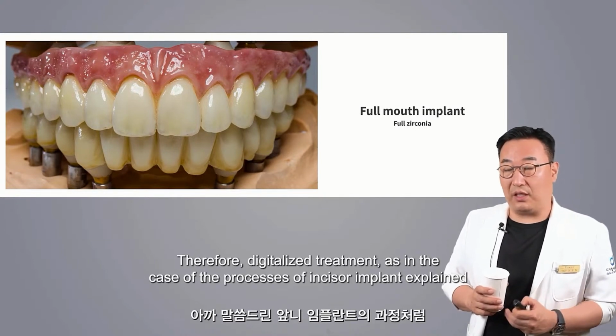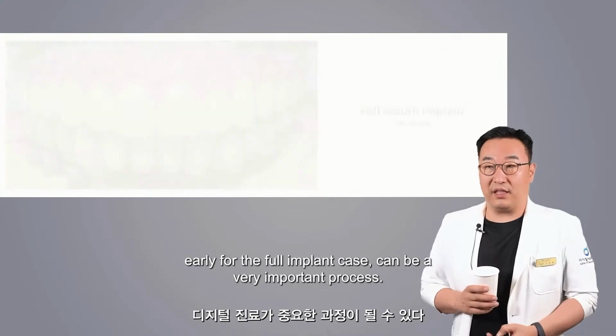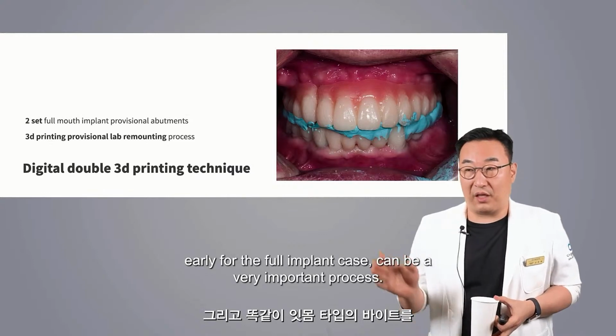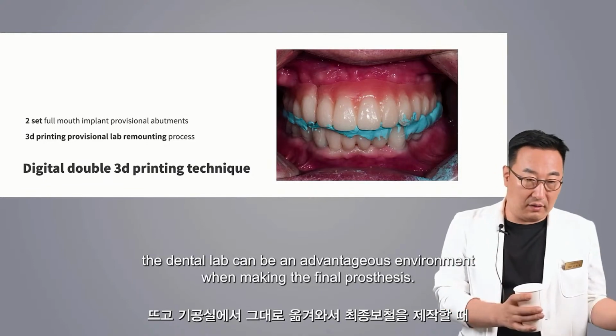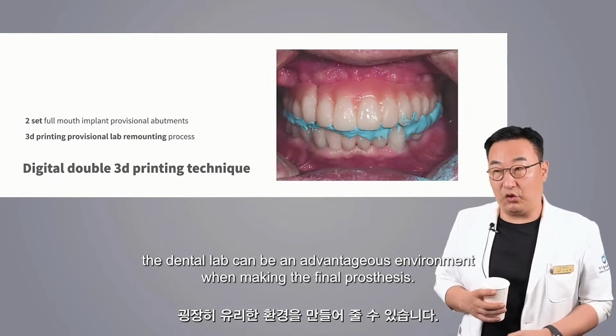Therefore, digitalized treatment, as in the case of the processes of incisor implant explained earlier for the full implant case, can be a very important process. In addition, by taking the bite of the same gum type and transferring it straight from the dental lab, it can be an advantageous environment when making the final prosthesis.